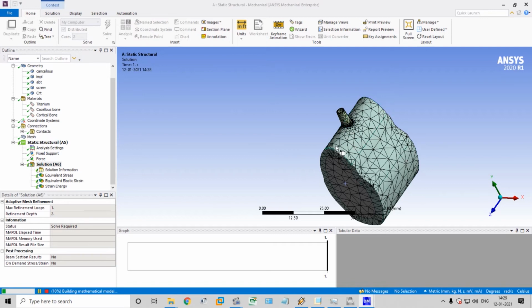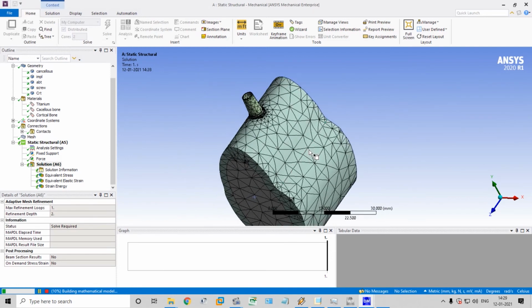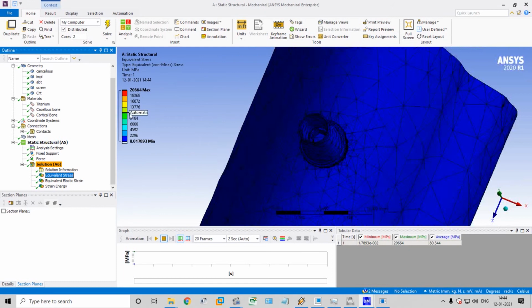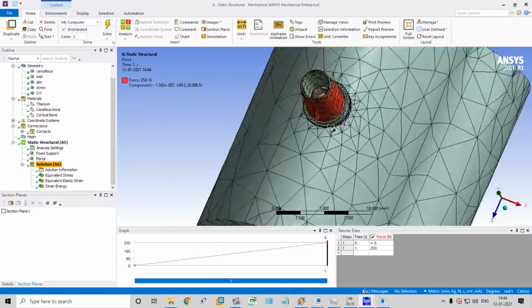The entire model will be solved by these factors: force and fixed support. Then the result will be written here by different color graphs. You can see it will take time, around 5 minutes. Okay, the solving was completed. Equivalent stress we can note here. Okay, all within the limit, very limited stress in the axial load. This load is in the y-axis.